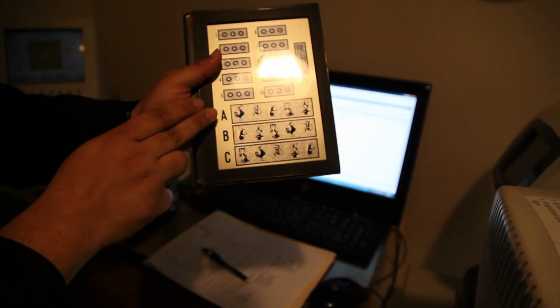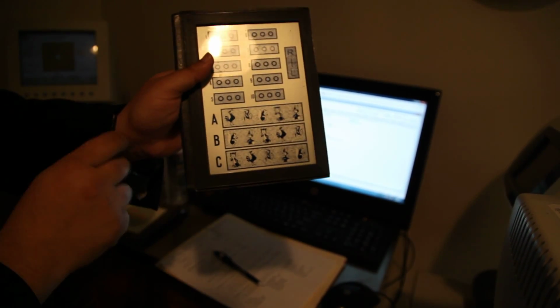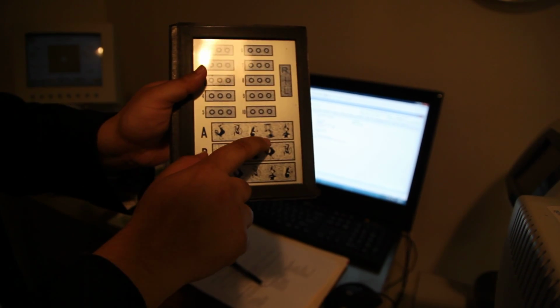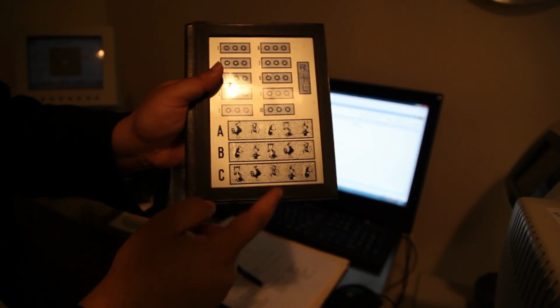Okay. For children, you're going to want to have them look at A, B, and C and ask you which one of the animals is popping out. The answers for which being A, cat, B, rabbit, C, monkey.